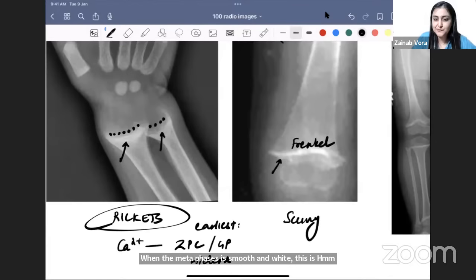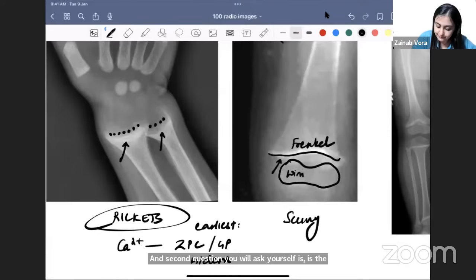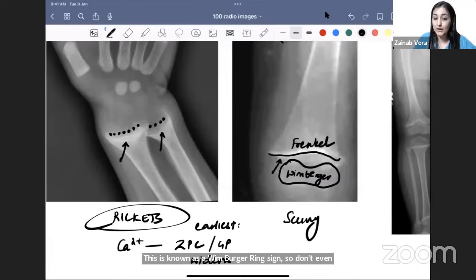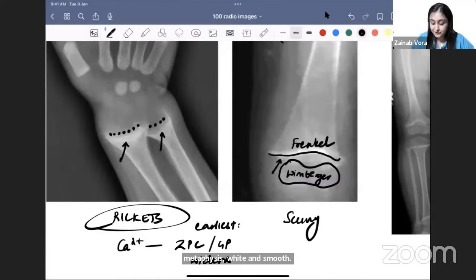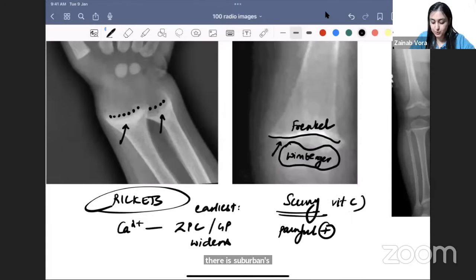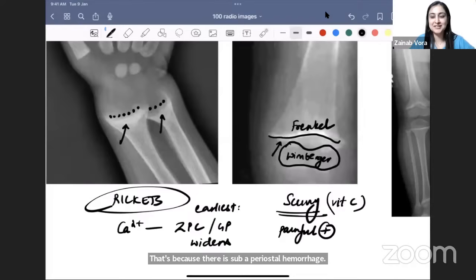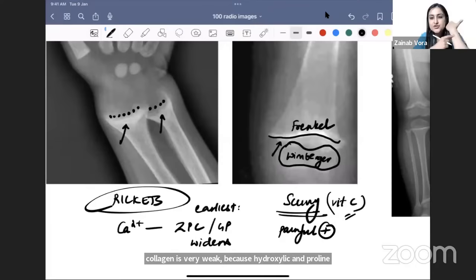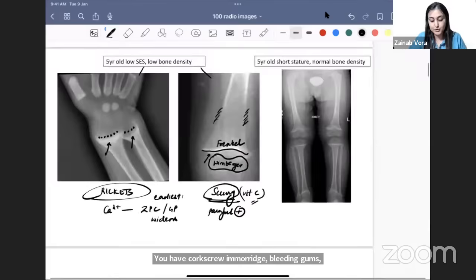When the metaphysis is smooth and white, this is scurvy — known as the white line of Frankel. In scurvy, look for two things: is the metaphysis smooth and white, and is the epiphysis very well defined? The well-defined epiphysis is the Wimberger ring sign. Don't memorize the names — always look for those two features. The child presents with a very painful limb and doesn't want to move because of subperiosteal hemorrhage, as vitamin C deficiency leads to defective collagen — hydroxyproline and hydroxylysine are affected.